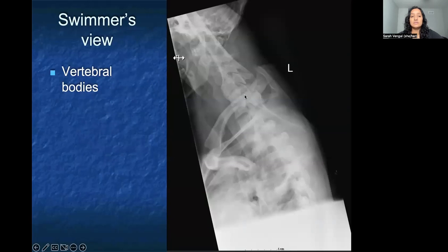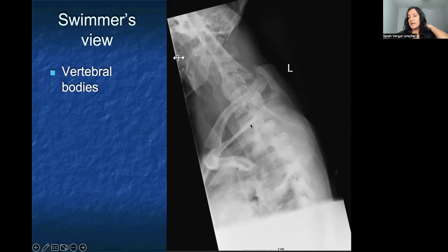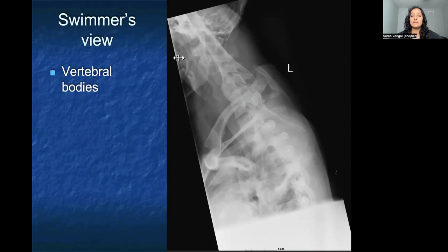Finally, there's the swimmer's view. The swimmer's view is best to help us identify the lower cervical spine and the upper thoracic spine. When a patient has pain at that junction posteriorly, I would get this swimmer's view to assess the vertebral bodies a little better, ensuring they maintain adequate height and to evaluate those intervertebral disc spaces.